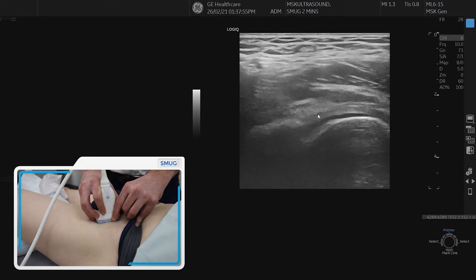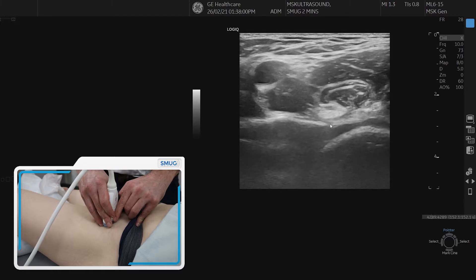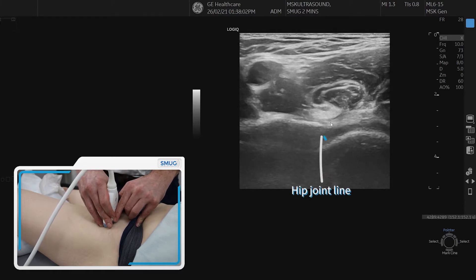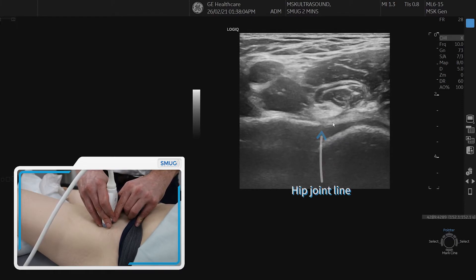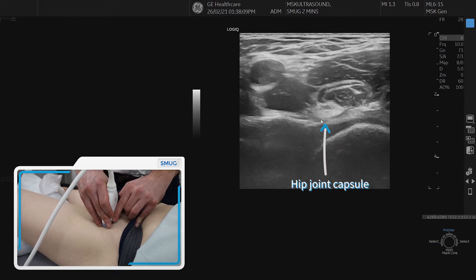If we go back into transverse section, we can also see that tendon sitting nicely on top of the joint. And you can see between the articular cartilage and the psoas tendon is the capsule of the hip joint.